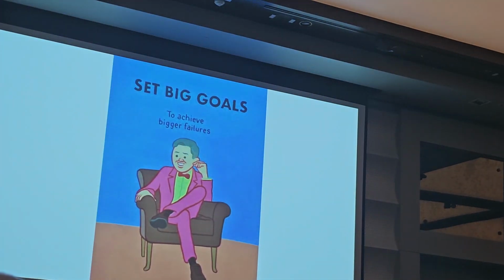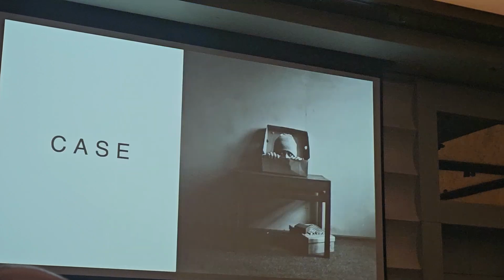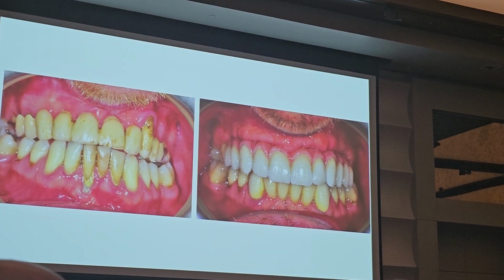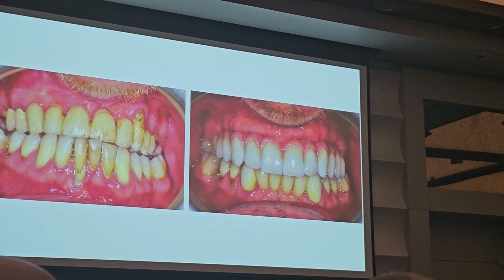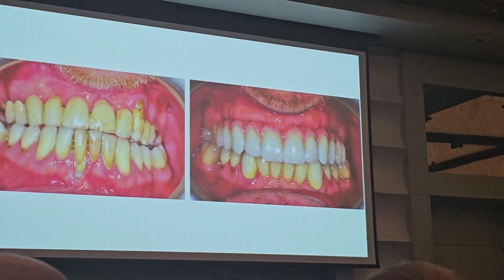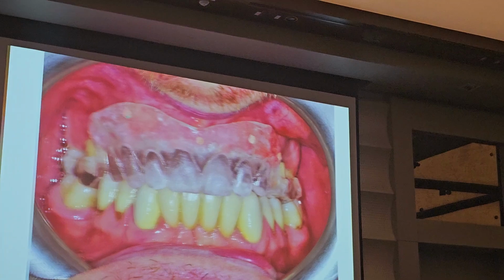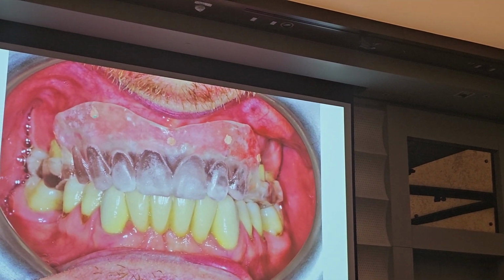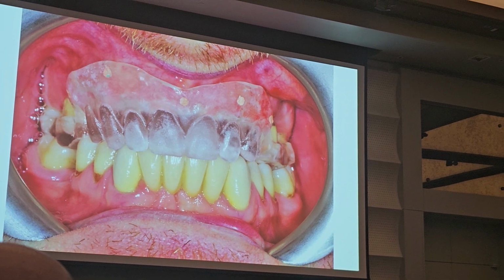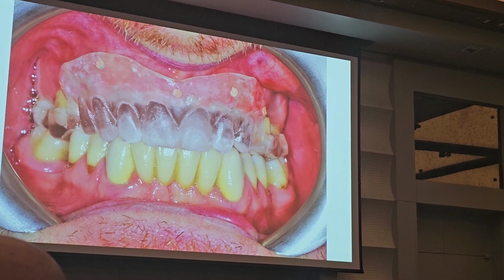Nowadays I have acquired some experience, which I did not have before. So when I do a case, I know how to do the case. I know how to do the mock-up, I know how to do the guided surgery. So now it's very easy for me to achieve a result like this. I don't use full guided surgery, I use pilot guided surgery for several reasons, except in rare cases.